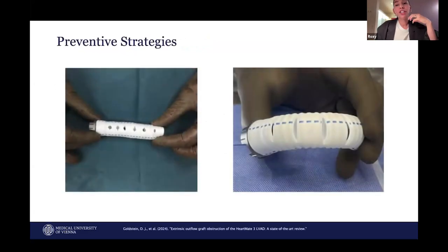What are the preventive strategies? Well, preventive strategies are pretty limited. We have two things that are actually presented by Ferbet al. This is also something on the left side that we can see that we do in our institution now, which are punches with a 4mm aortic punch into the bend relief. Also, by Goldstein, there has been presented an anatomical approach with the slit technique, but both techniques have the same goal, to really help the biodebris to get out of the way.